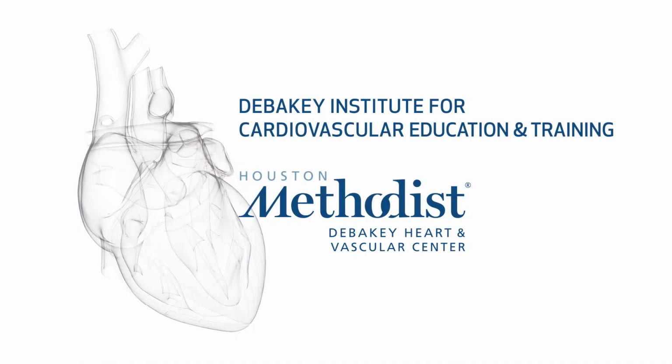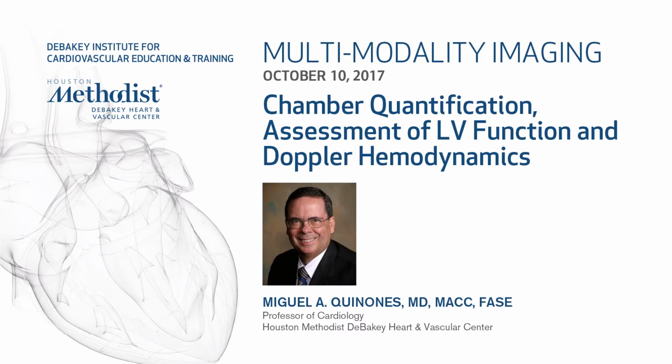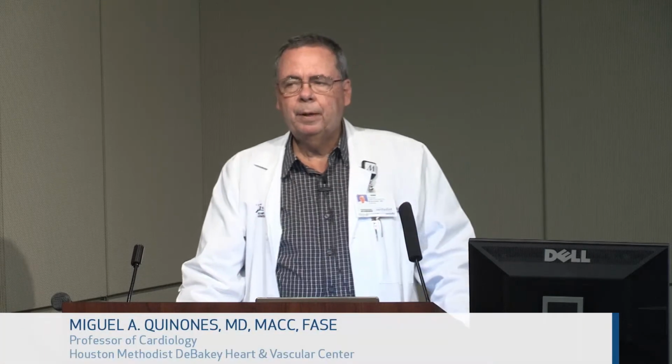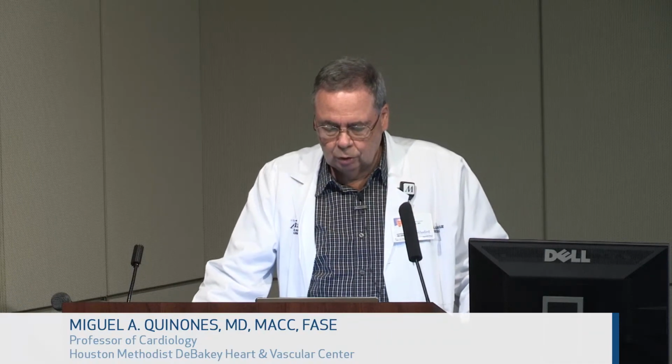Good afternoon, everybody. So today we're going to talk about chamber quantification, assessment of LV function, and Doppler hemodynamics. And we're going to really dedicate the time to the left ventricle, first of all because of time limits, and also because that's the function we do the most.